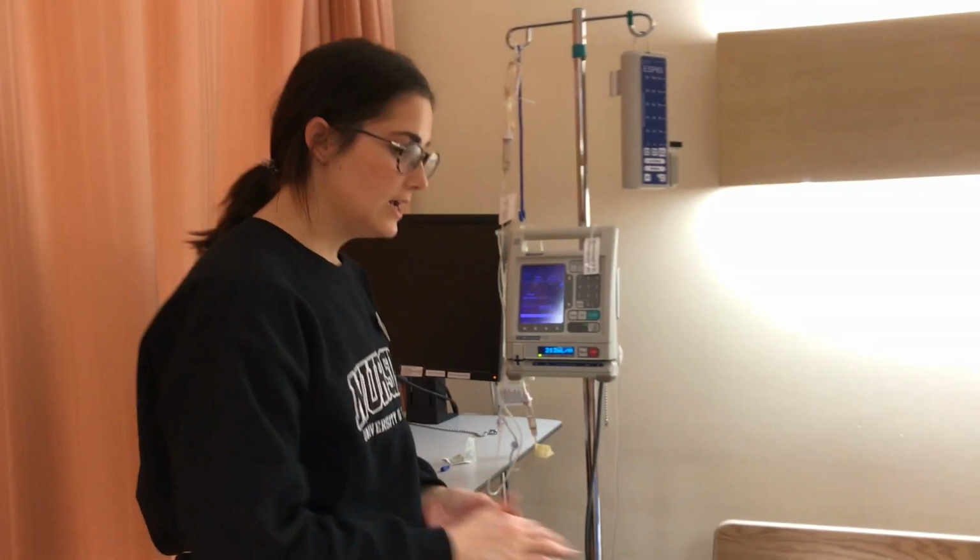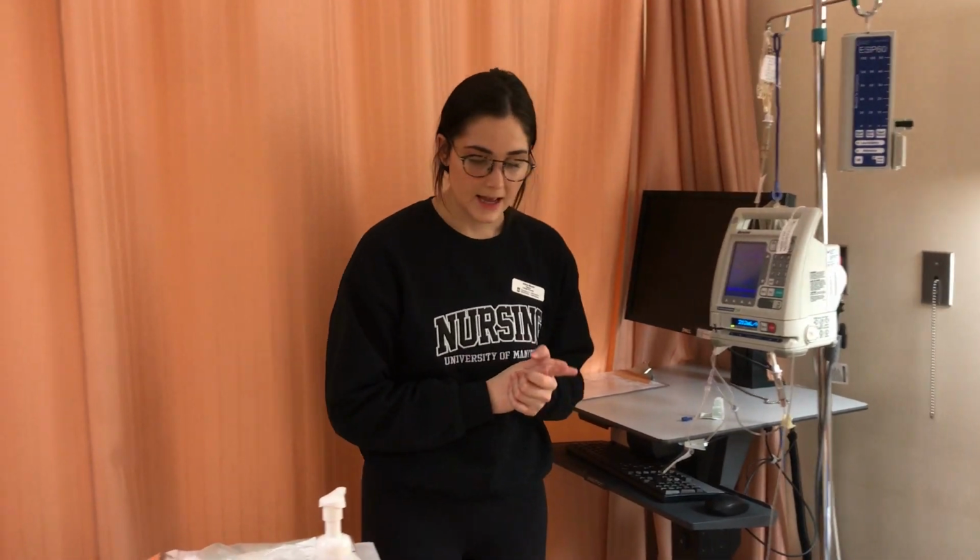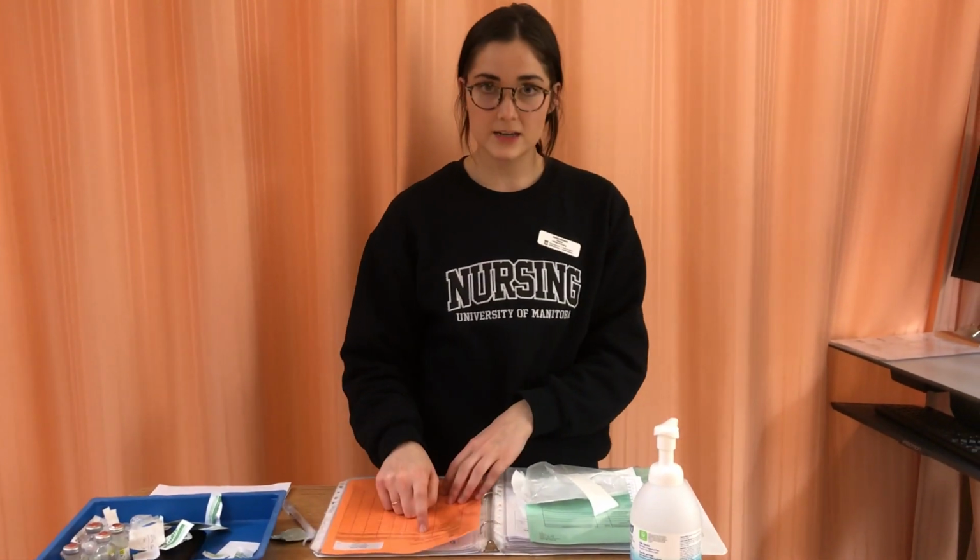symptoms we talked about. I'm going to double check that this is still patent, do an exit safety check and make sure everything's in order. I'm going to bring everything out and quickly sign my MAR with my initials and the time.